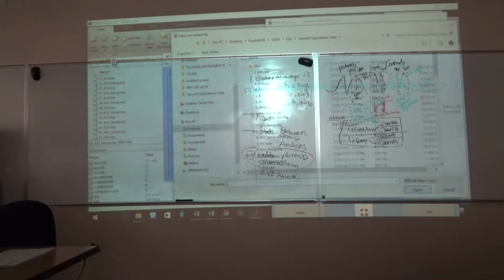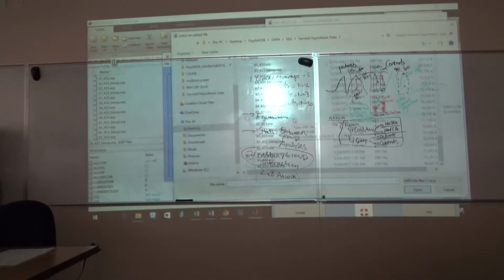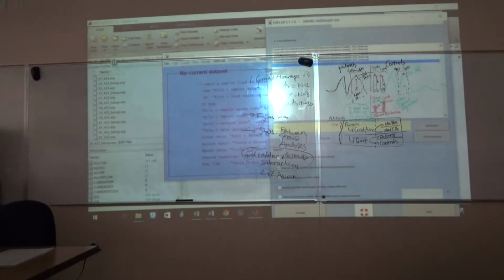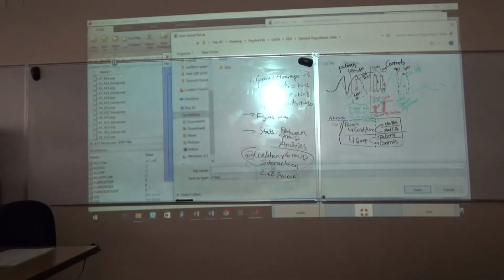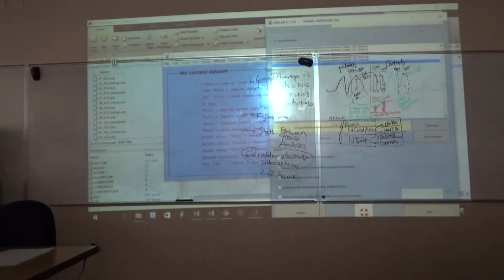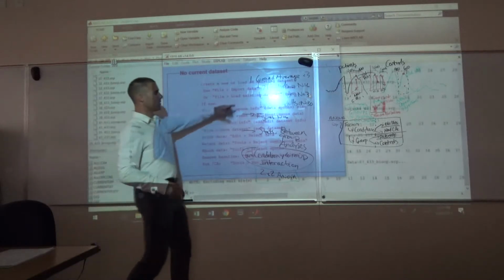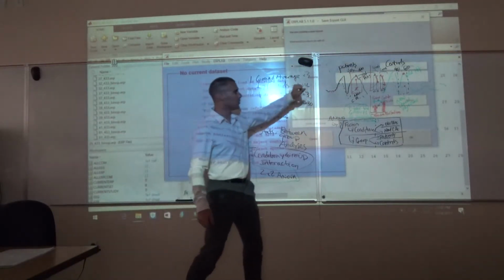I'm going to grab my controls, which is basically subjects 81, 82, 83, 84, 85, and 87. Okay. It's going to ask me to save the list, which I'm going to do. I'm going to call it controls N of 6. And you just hit run. And it'll ask us to save that when it's done. And that'll take care of running our controls.